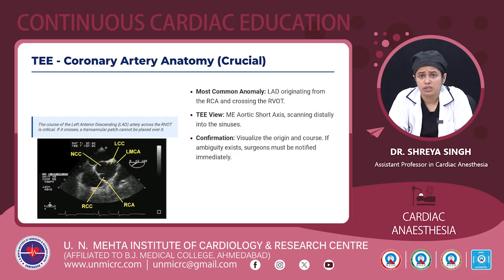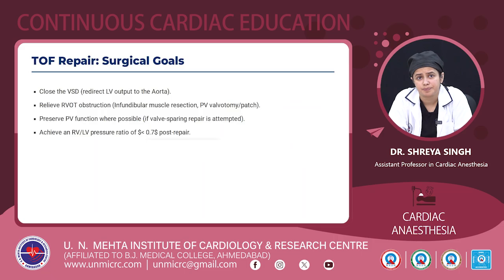Coronary artery anatomy is also crucial here. The LAD could be originating from the RCA and crossing the RVOT. The mid-esophageal short axis view is usually used and scanned distally into the sinuses. And it should be visualized for the origin and course. And if any ambiguity exists, then the surgeon must be notified immediately.